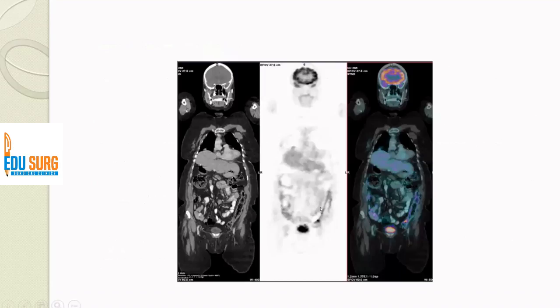Now, this is a patient in the recurrence setting. She had a mildly elevated CEA level. You can see that there are some changes over here of liver resection surgery, and there is nothing in the abdomen. There is no hypermetabolic area in the abdomen, but you see this very low grade uptake in the thorax, which corresponds to a lung nodule in the right lower lobe.